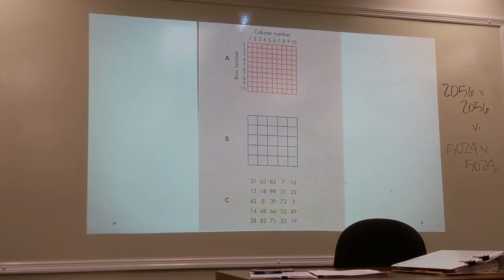Well, the other one is not digital. I don't know, I'd have to look up the stats on this. The reason that the cassette is smaller, even increasing the SID, with the increase of the pixel size, so we can recover, well, all you're going to recover is detail. You're right, detail, but we're talking about the detector size. I'm talking about positioning purposes.